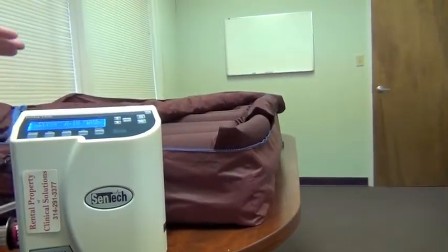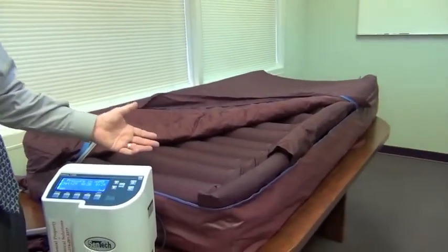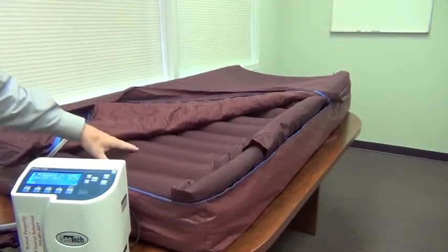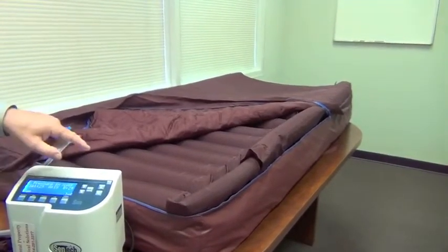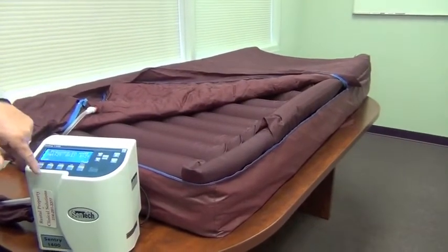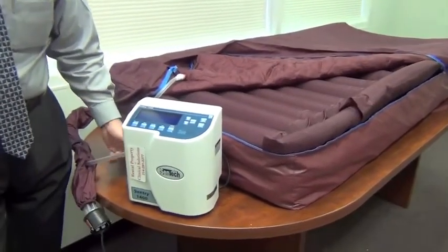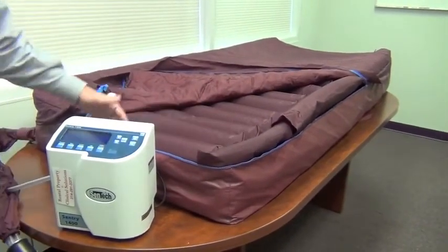And they actually add about 3 inches of additional height to the periphery of the mattress. Again, primarily there as a reminder to let the patient know they're approaching the periphery of the mattress. They're a safety feature. They can be deflated. If you're getting somebody in and out of this product, what I would strongly recommend for safety reasons is to let the patient know what your intent is, obviously. I would deflate the side bolsters, turn the unit off, disconnect the air supply here as though you were performing CPR, and now the patient's weight is going to bring them down very slowly to frame height on the bed.